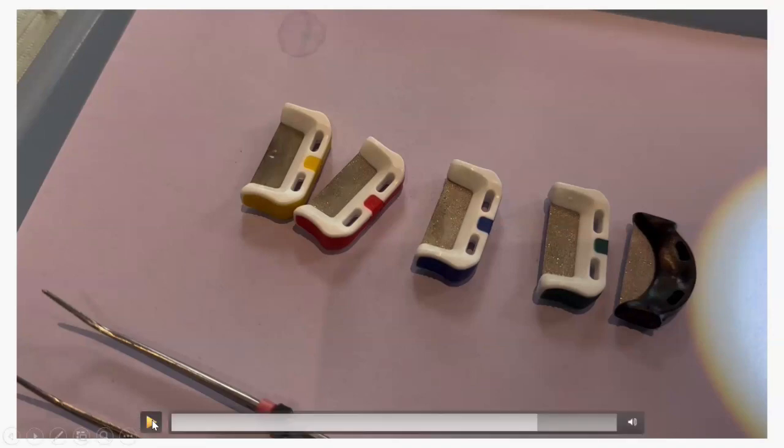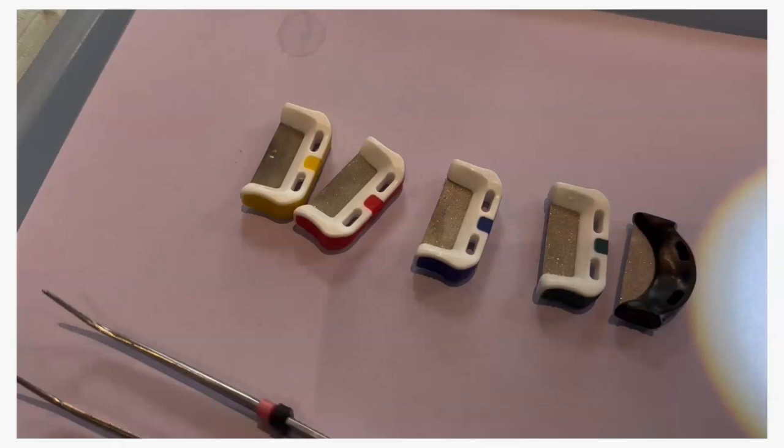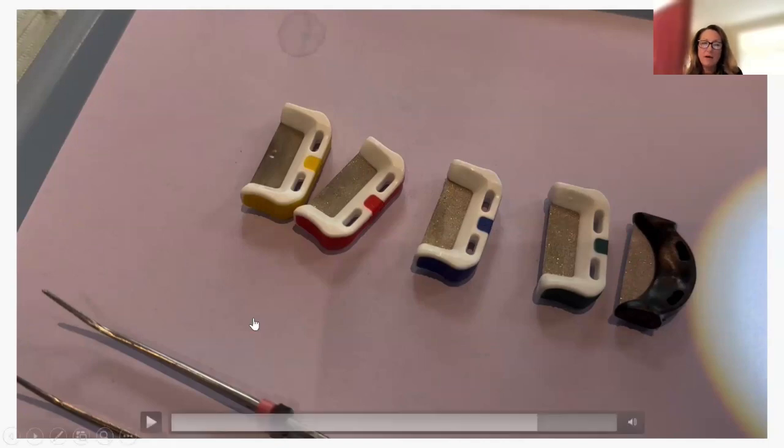And somebody also commented before I asked the question that it's a great idea to place attachments a week later. I'll do that. Thank you. Yes, and I love that idea also. It's like, then they get used to taking it in and out.